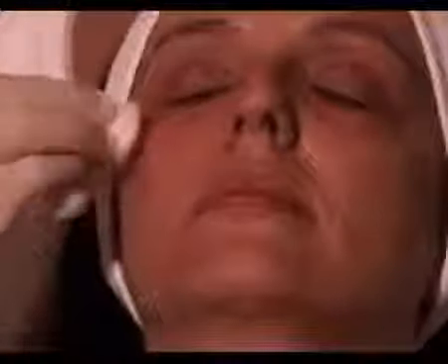Now I'm going to ask her to sit up, and I want you to see how she looks. So do you guys see the results on the outside? All right, fantastic. So what I injected here was about 1.5 ml of Ultimate, and I've injected about 0.4 into the tear troughs and maybe 0.1 or 0.2 into the palpebromalar groove. And this is basically how she's going to look. And that's basically it. She's going to get a little bit of swelling because of the injection areas, but this will all go away with time.